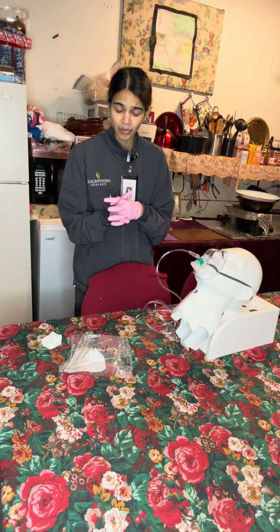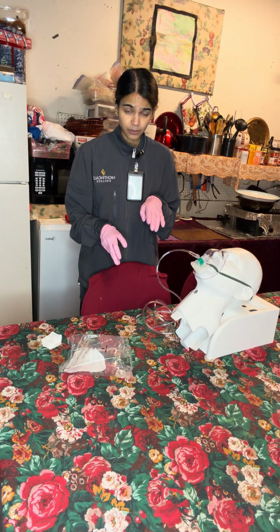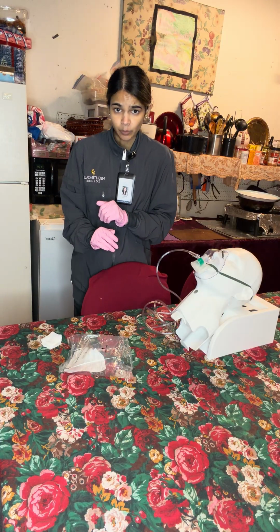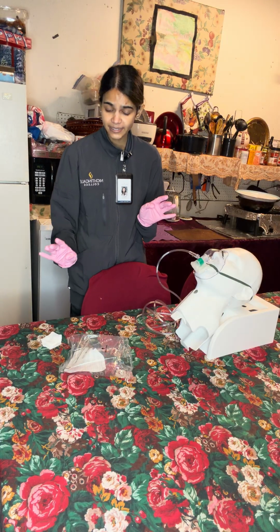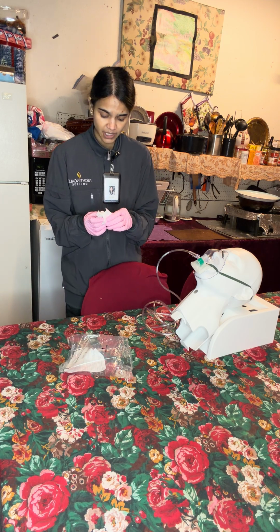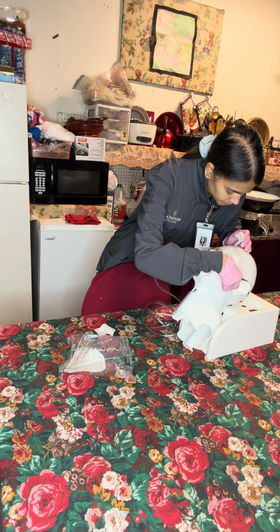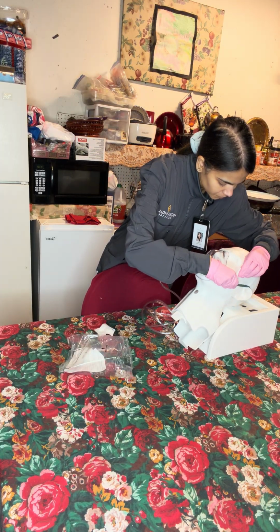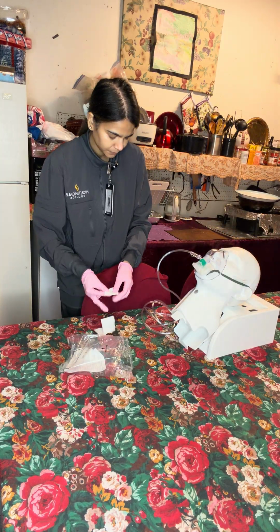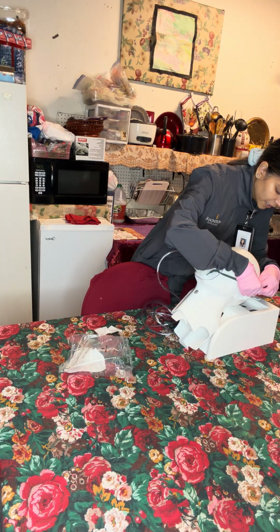Once that has been applied, I will also check for skin integrity every 4 hours to ensure that there's no redness, no irritation, and no skin breakdown. If there are signs, we can always use gauze again and place it on the areas that have the most sensitivity. And this will be your cheeks and around the ears.